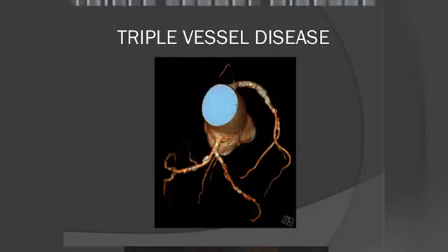This is an image showing you triple vessel disease. So all the arteries can be diseased.